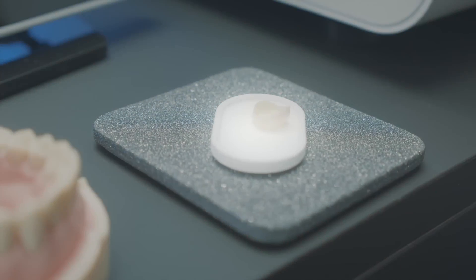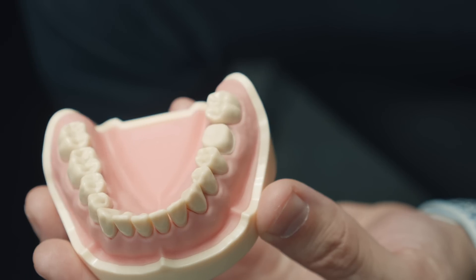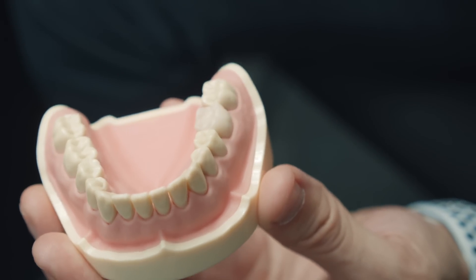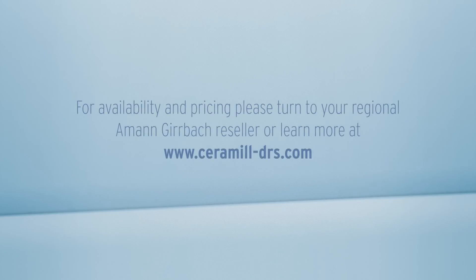I'm quite impressed with the very precise fit on the die and the topography on the occlusal surface of this restoration — it's incredibly detailed. Once we have this part complete, we can now stain and glaze the crown for additional characterization.